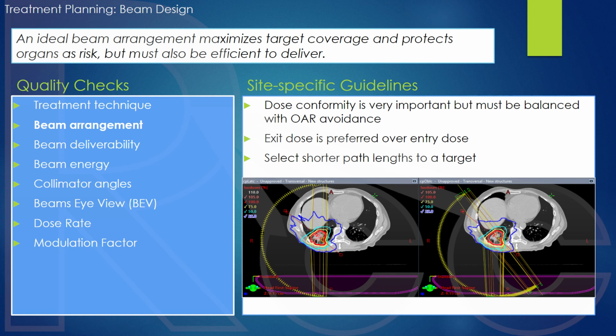I think I found a lot of that is really the preference of the physician. We choose full arc as mandatory because our physician believes you need to give enough intermediate dose to kill the tentacle of the tumor. So that's why Dr. Timmerman really speaks highly about needing enough dose at the 70% isodose to be also conformal. But there is no direct outcome study to say you definitely need to do that. So ALARA is also important.